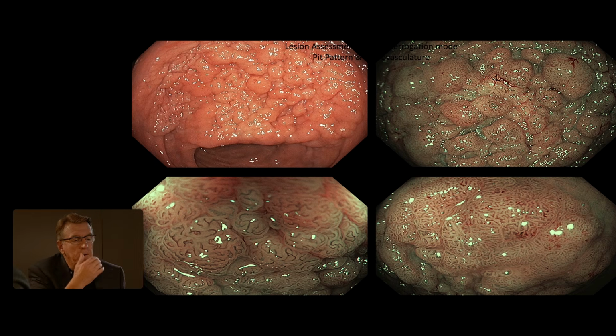So the steps are, you look in overview and you make an estimation. We've covered those things: location in the colon, straight scope, clean the lesion thoroughly. If it had adherent mucus, we can go down that. We haven't covered serrated lesions yet, but we'll come to them. So this is an adenoma.